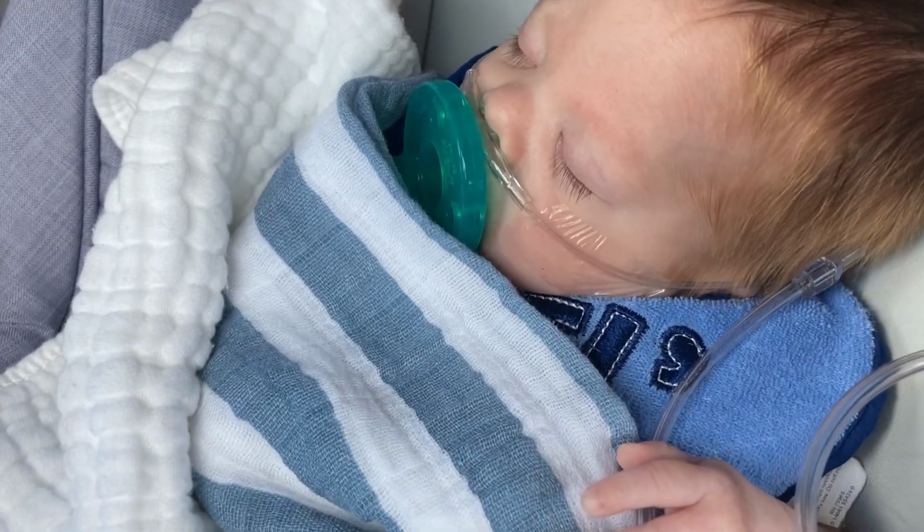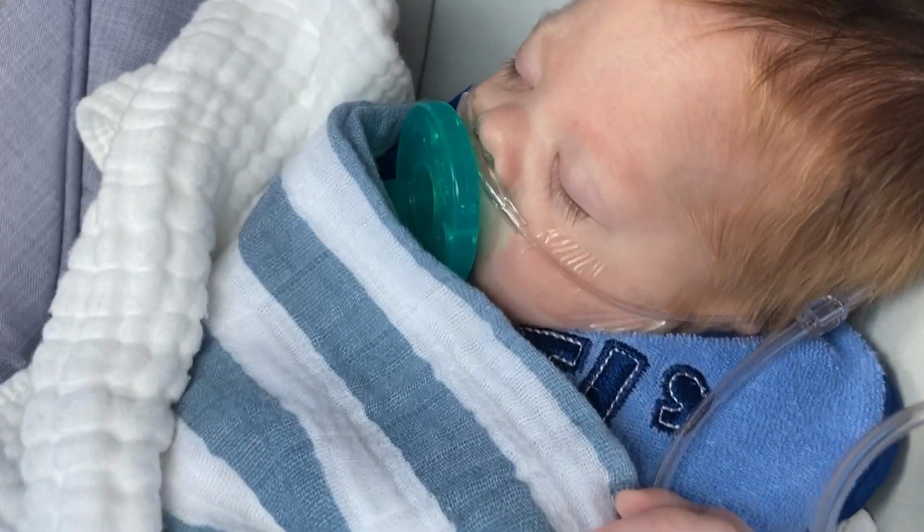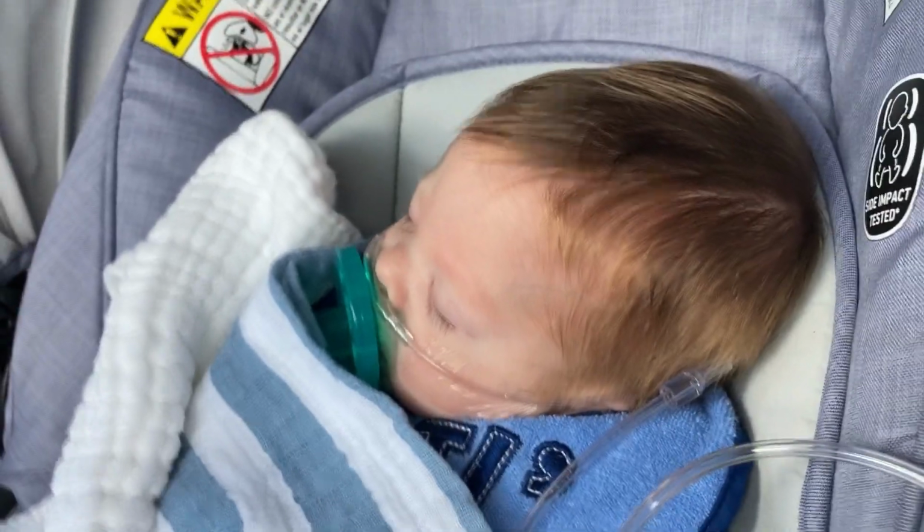I probably should have shown on here, but I just retaped his oxygen cannula. You change the cannula out every week. The long cord that goes throughout your house and plugs into your concentrator, you change every 2 weeks. 10 days, 2 weeks-ish. They give you 2 a month, right? Yeah, so about 2 weeks. We order things monthly at the end of the month.